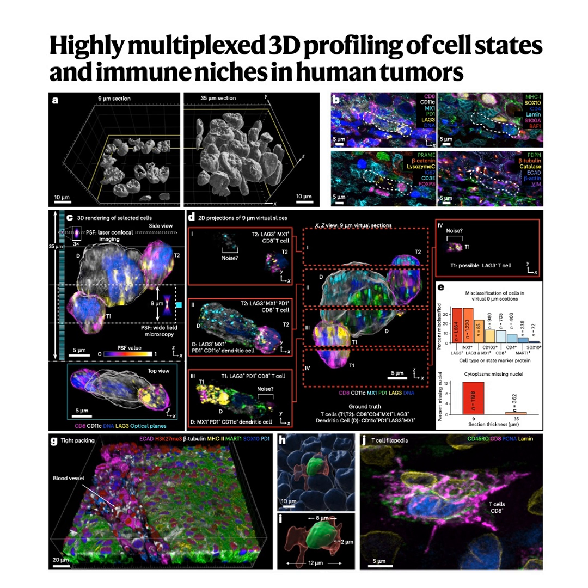Well, it happens largely because most analytical software, the tools researchers use to automatically analyze these images, rely on finding an intact nucleus. The nucleus is like the cell's ID card, right? The software finds the nucleus, defines the cell boundary around it, and then assigns its identity based on the markers it sees. But if that nucleus is mostly chopped away by the thin slice, the software often just discards any signals like protein stains in the cytoplasm that might remain. It can't confidently link them to a cell. Okay, so the cell might technically be there, or at least a piece of it, with important proteins, but because its nucleus isn't clearly visible in that thin slice, the signal essentially gets thrown in the digital trash bin. Exactly. Lost data.